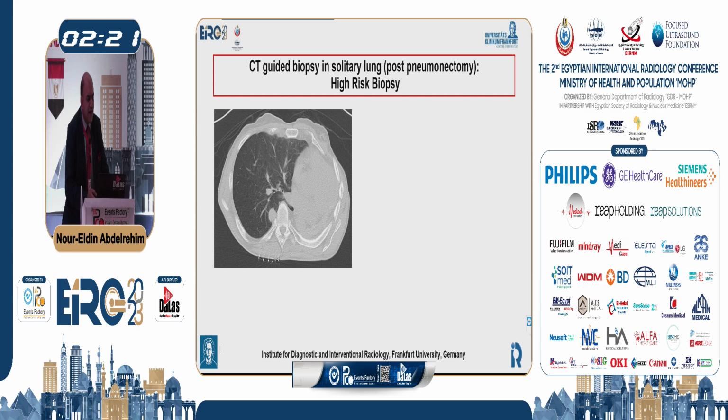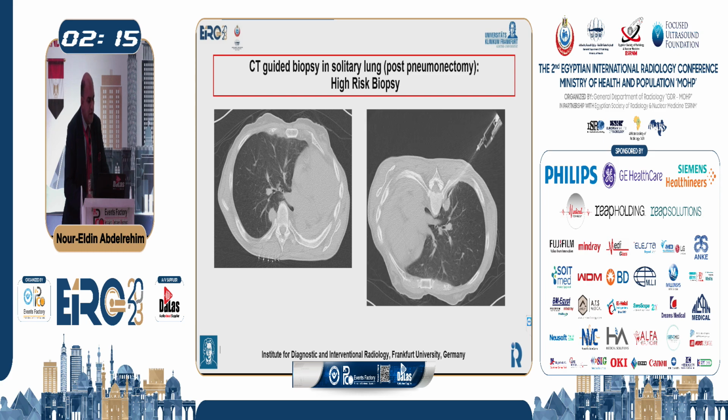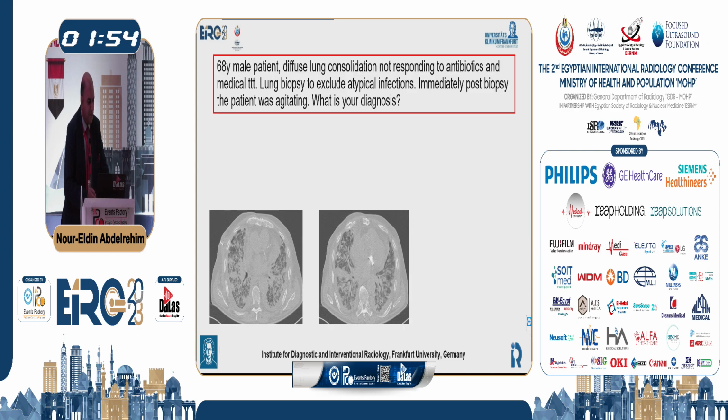This is a challenging case in which there is a post-pneumonectomy patient who had a lesion. You don't know whether it is a metastasis or a new primary. In such a case, it should never be done as an outpatient. In principle, the patient should be done under CT in hospital, with a ready team like anesthesia to make immediate intubation in case of compression of the lung due to complication.